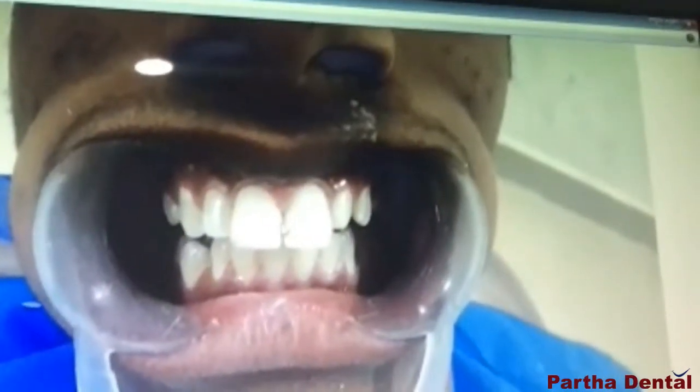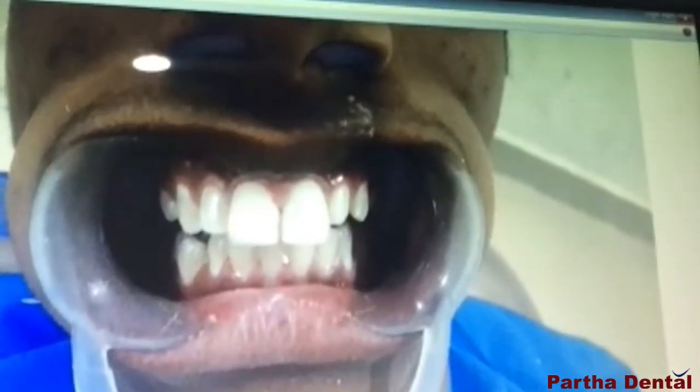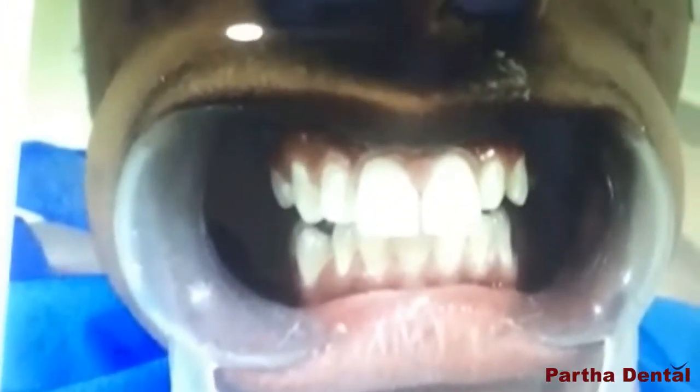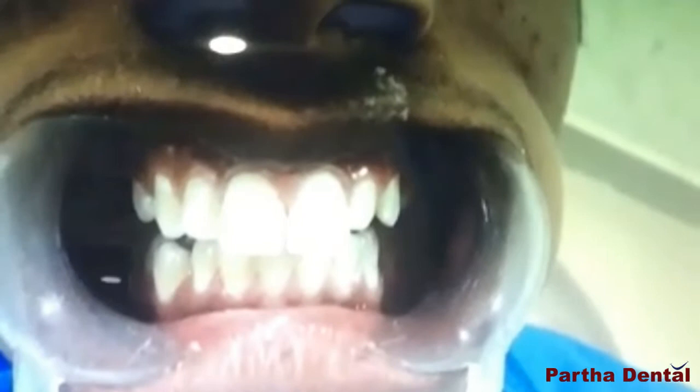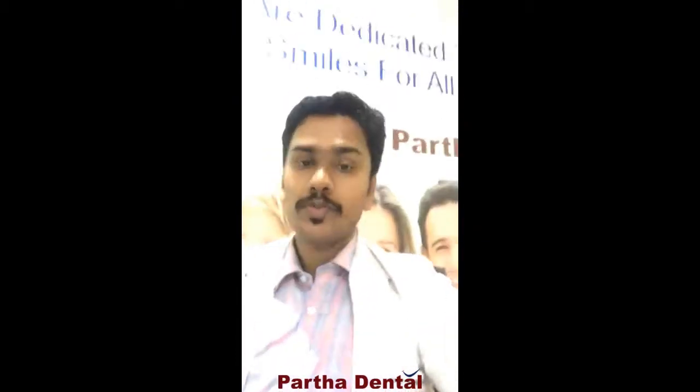You can see that we have restored this to the proper anatomy of the tooth structure — it is going to look like what it was before. This is a very specialized treatment we do here for restoring broken teeth. You can see that the broken tooth has actually been replaced in the same manner it was looking before. It is looking much, much better than having a fractured tooth.